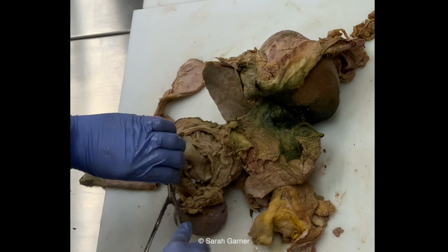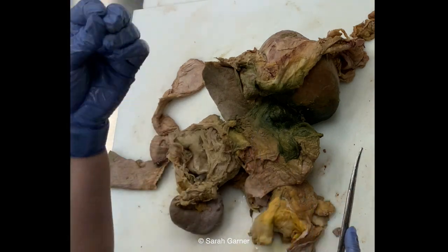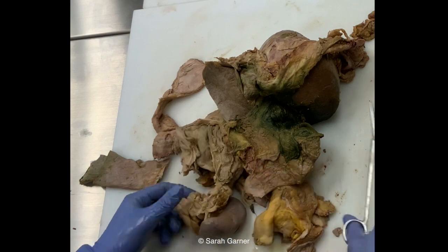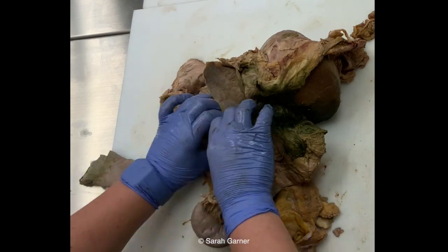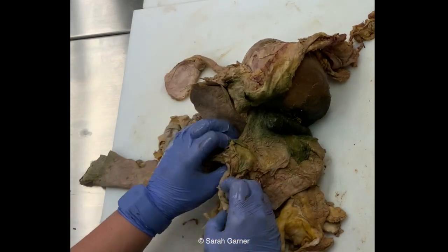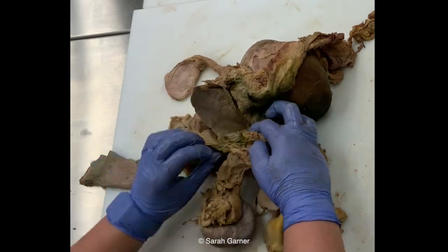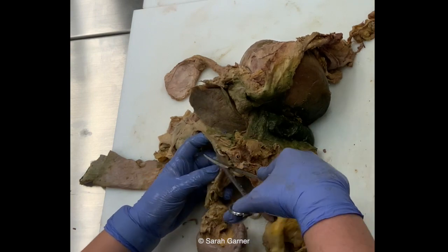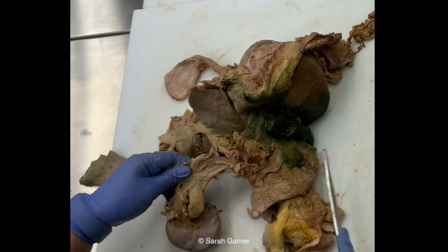A lot of this may be hard to see on the camera, but again, it is literally all about feeling. You can feel that this is just a thin sheet of peritoneum. So you know that you can cut that. Okay, so now our esophagus and our stomach are beginning to be almost freed up, right? And then it's going to be pancreas, right?